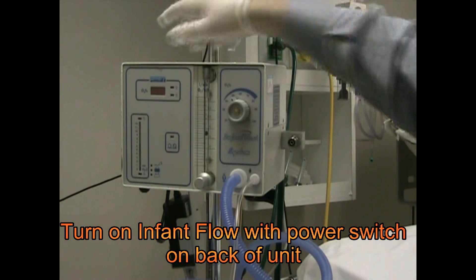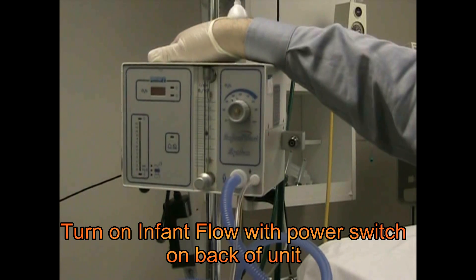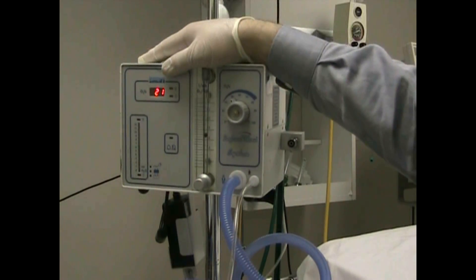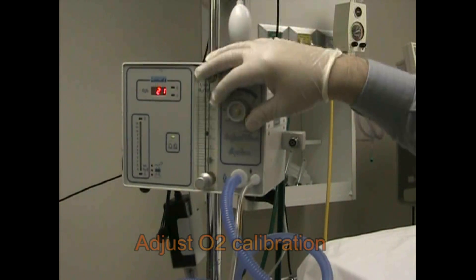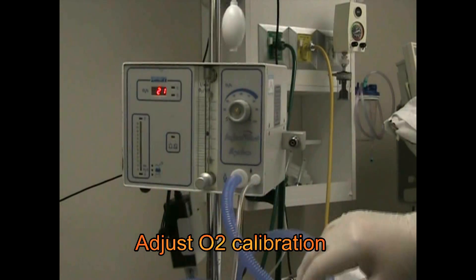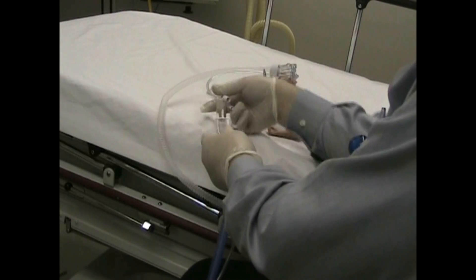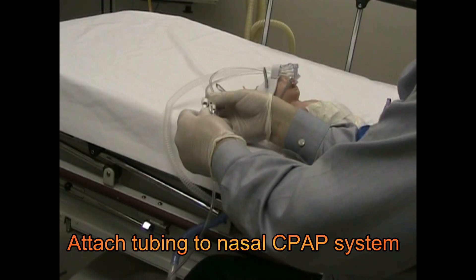Now we're ready to turn on the machine. There's a power switch on the backside and it's going to turn on. We're running on 21% oxygen — we don't have piped-in oxygen, but if we did we would adjust our sensor here. We have our alarm, and now we're going to go over to the infant and connect these two parts together.